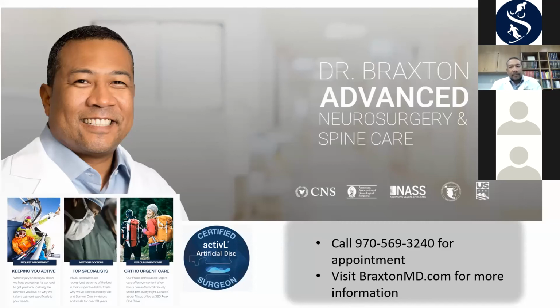Dr. Braxton, this is Leslie, and I've been looking at the chat, and there was just one question about limitations from a physical therapy stance on spinal cord stimulators, if there's any precautions. I did answer that question by saying that the limitations are for the first 8 weeks, and once they are past the healing process, we generally allow them to return to any regular activity. But I wondered if you wanted to expand on that at all.